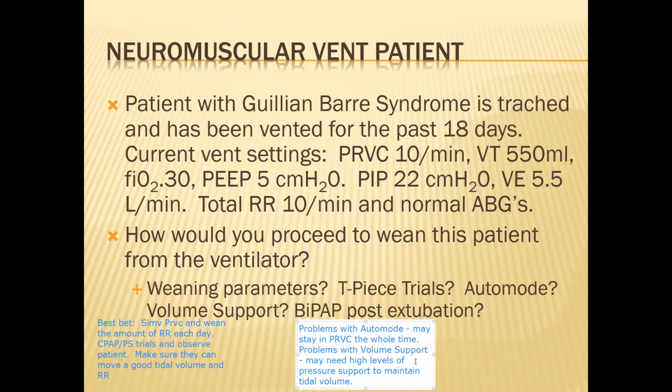And I think that was it. So problems with auto mode, they may stay in PRVC the whole time. And then problems with volume support, if you use volume support to wean the patient, they may need high levels of pressure support to maintain tidal volume.